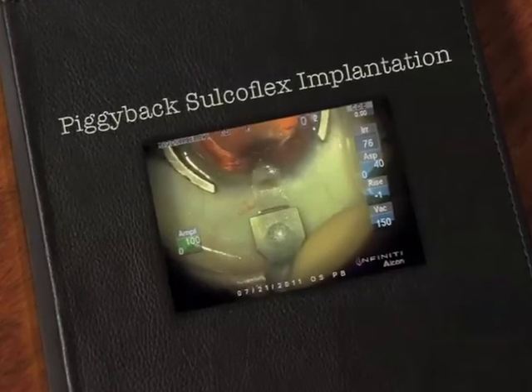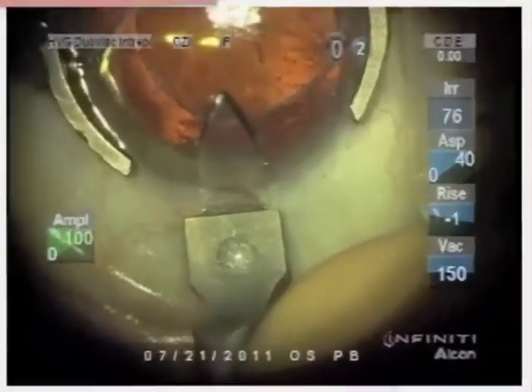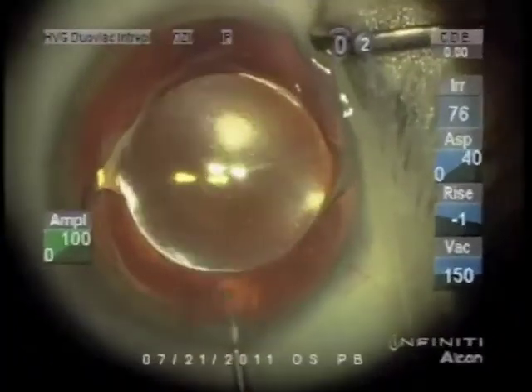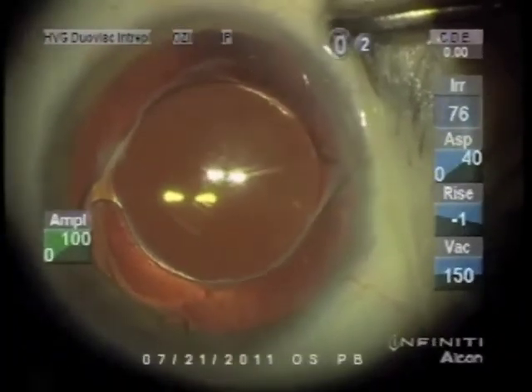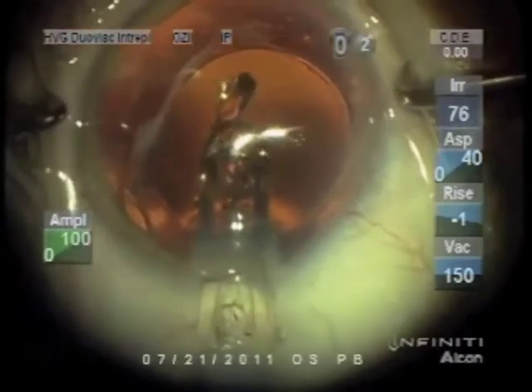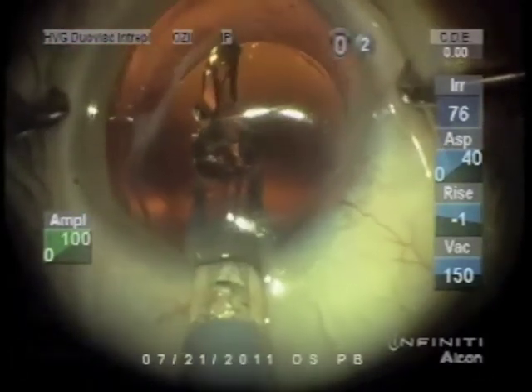Dr. Gimbel is showing a Sulcoflex piggyback lens being inserted for refractive correction. You can see a nicely placed implant in the bag, but in an inappropriate power.